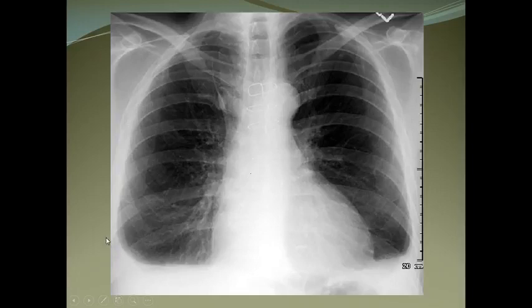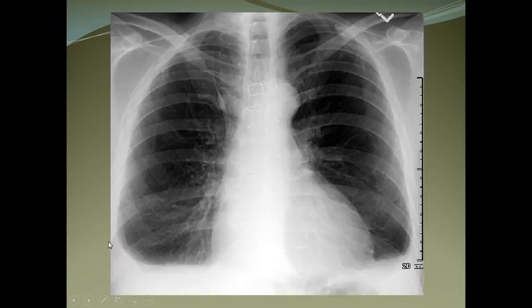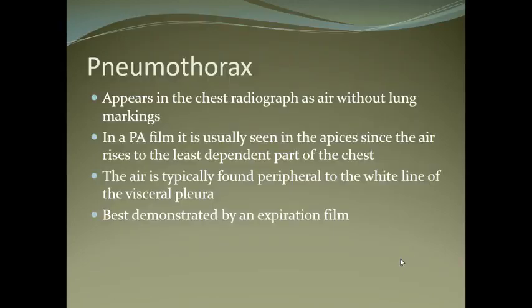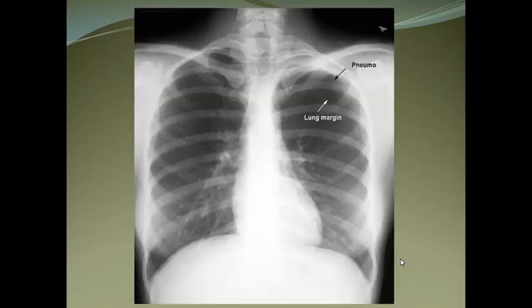Pleural effusion causes blunting of the costophrenic angles. Pneumothorax means collection of air in the pleural cavity — you can see there are no lung markings beyond a certain line.